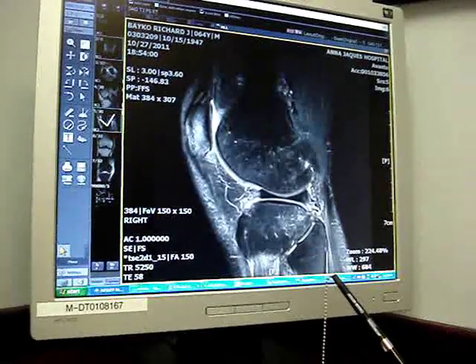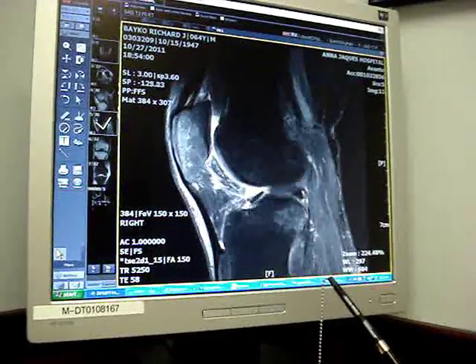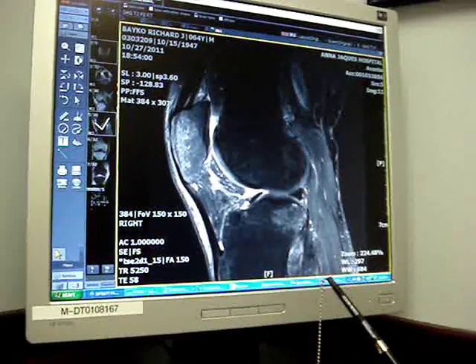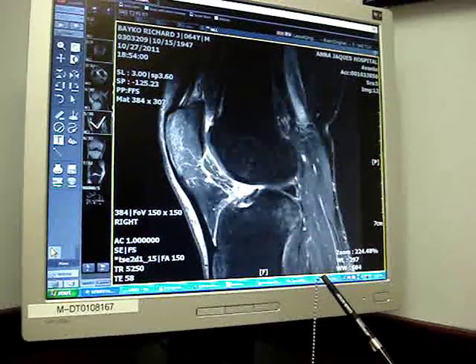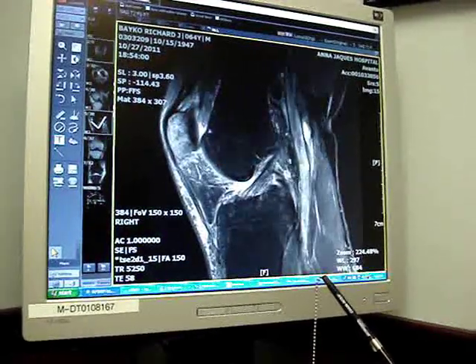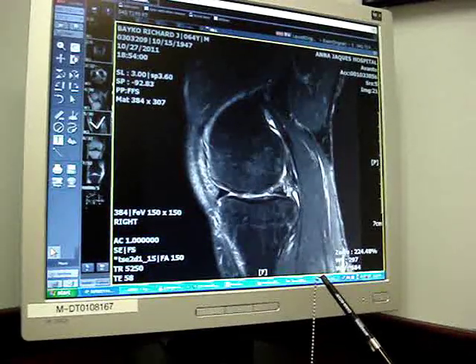Another view — this shows fluid as white. The outside looks great. Coming in, you get little bone bruises here — see that white — that's probably from when you fell and bruised the bone. And that's what that is there. The ligaments look good again. Come in here — that meniscus is just all chewed up.